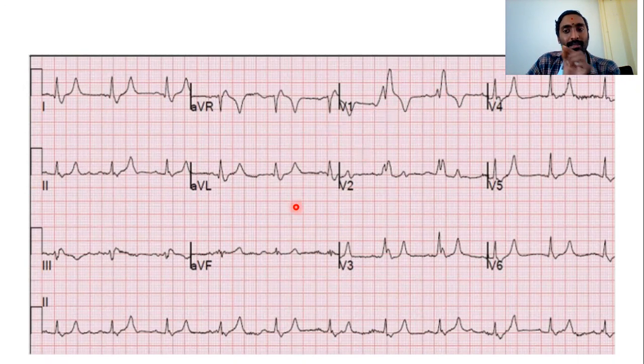And very, very important is to look at the T wave. The T wave here is almost equal to the height of the R wave. Here also you see the R wave and the T wave look equal. And here you see in the precordial leads, they appear somewhat pointed. Here in V3, V4, V5, the T wave is appearing pointed. So whenever we have a tall, tented T wave with widening of the PR interval, it is classically suggestive of hyperkalemia. Although this ECG may just be an innocuous right bundle branch block, there is an underlying hyperkalemia that is hiding.